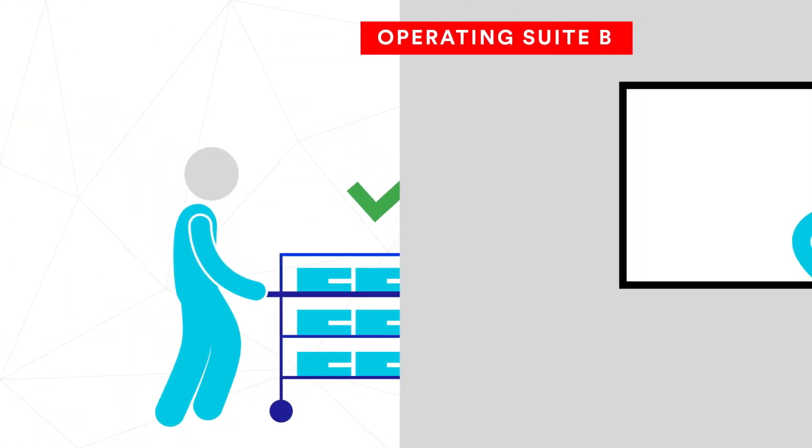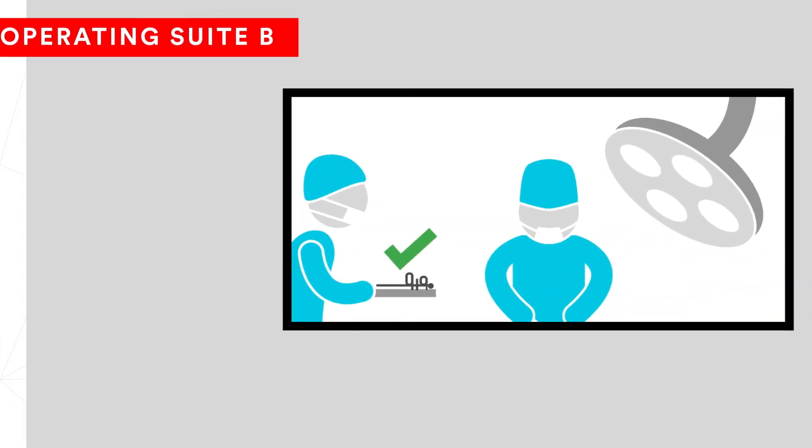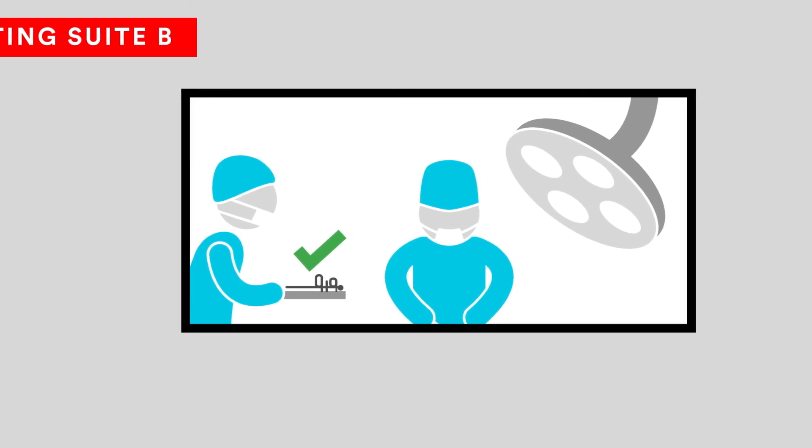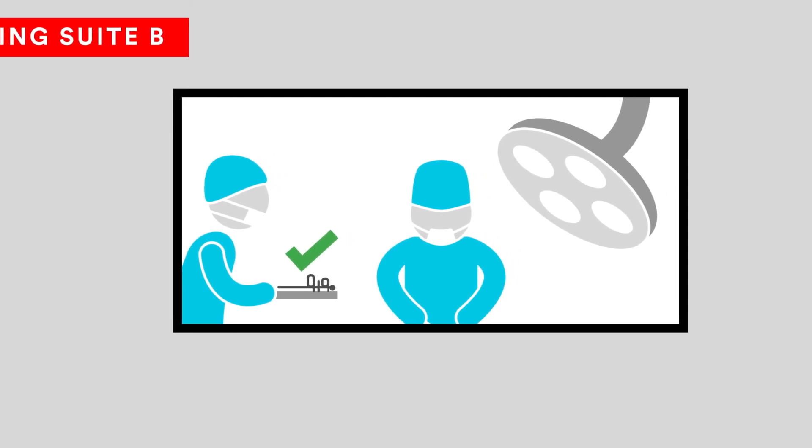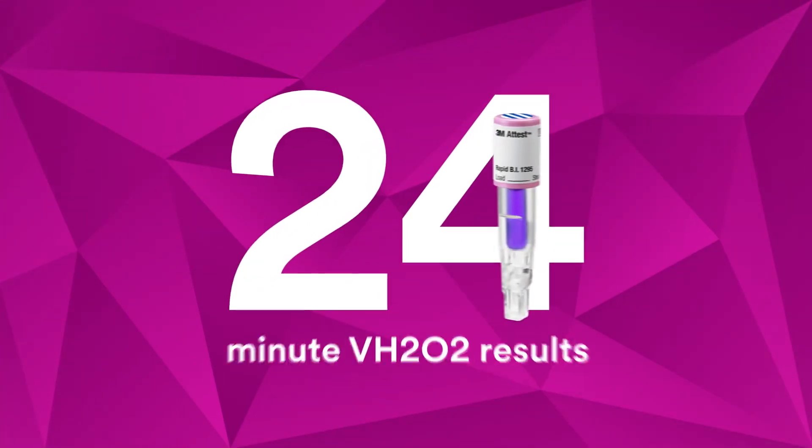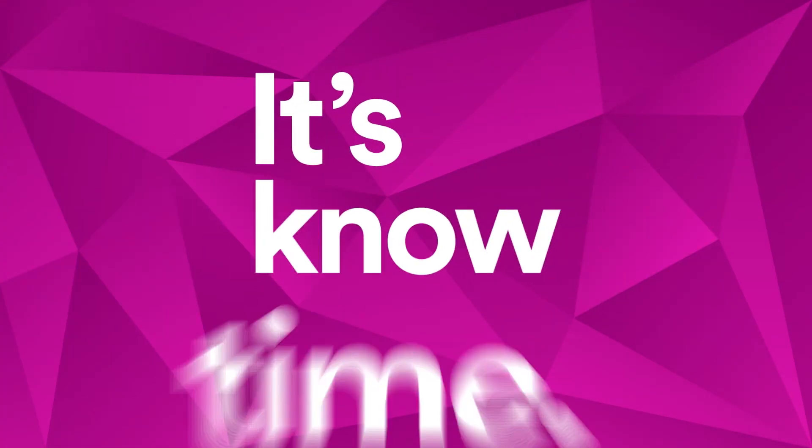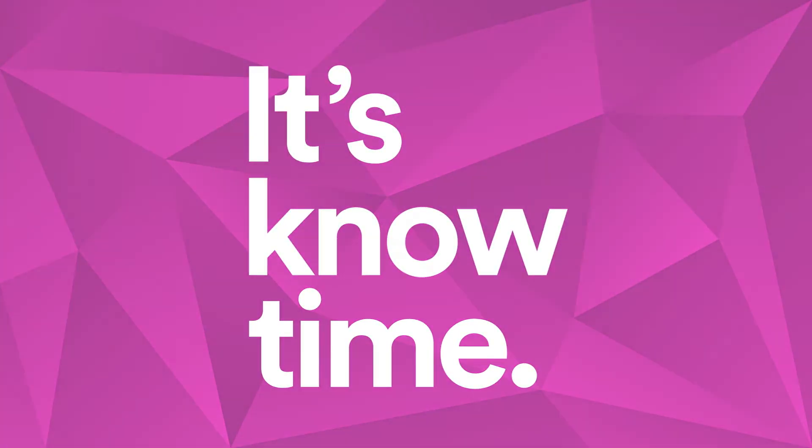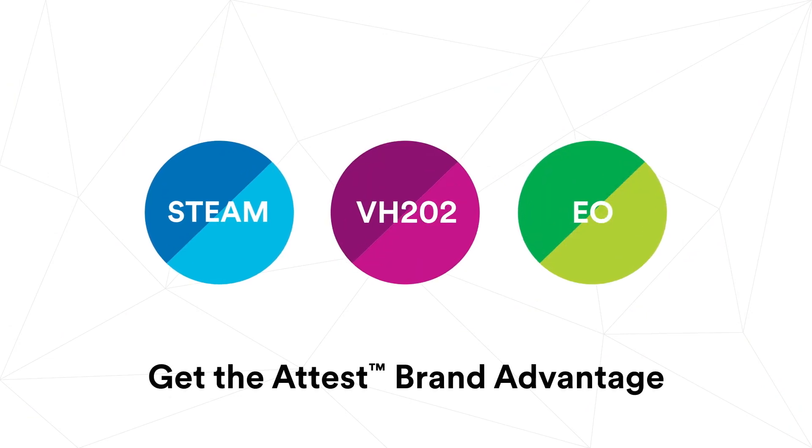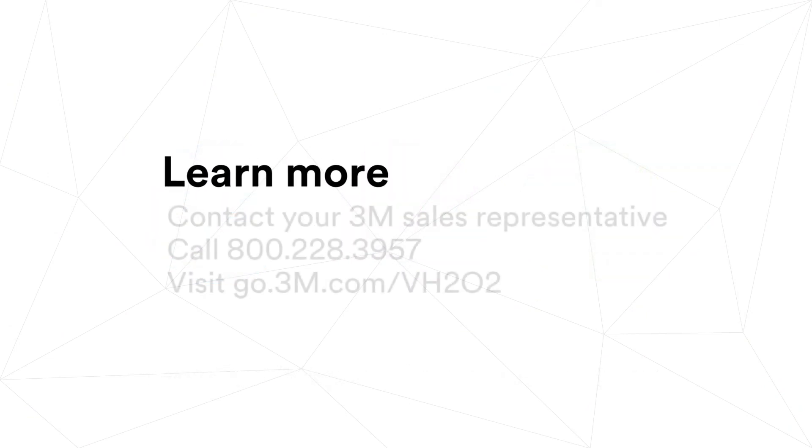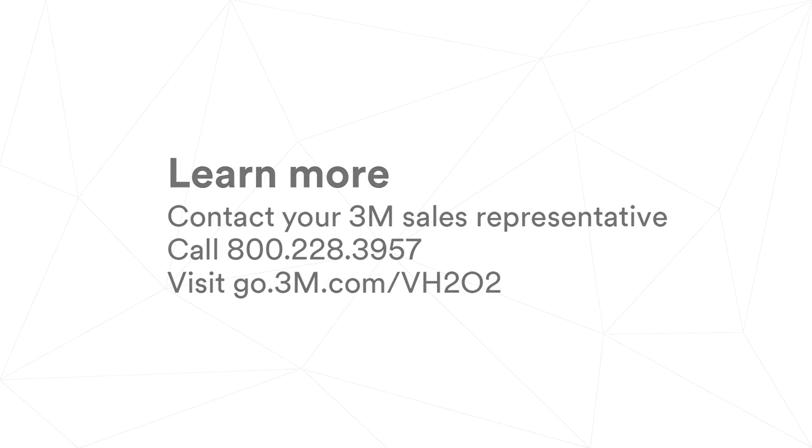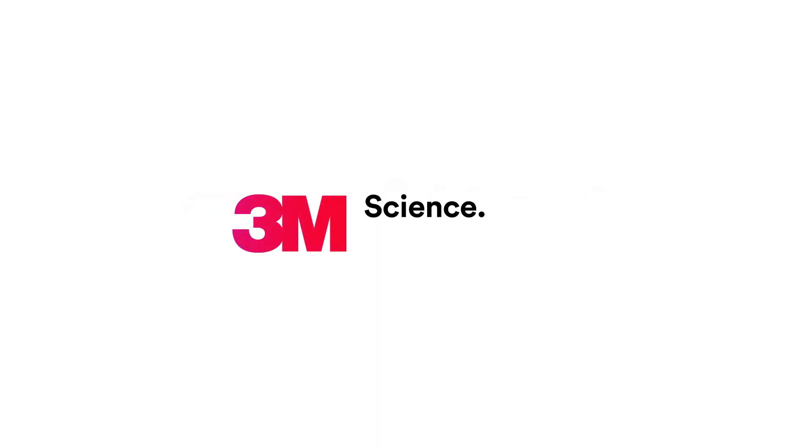Get the confidence and peace of mind that comes from knowing results even sooner for every vaporized hydrogen peroxide sterilization load. Take control with 24-minute results and know for sure every time.